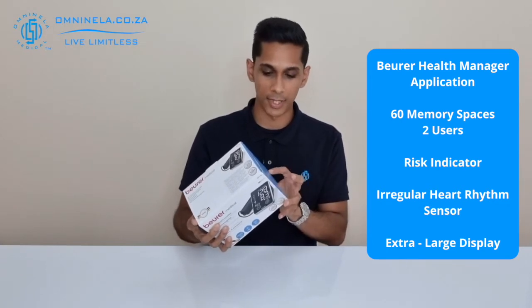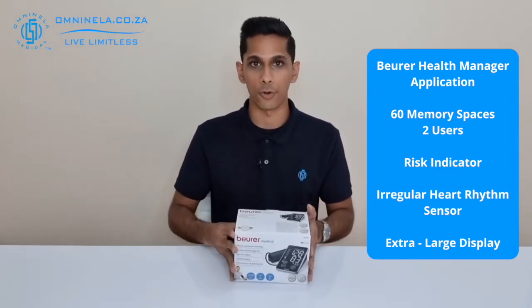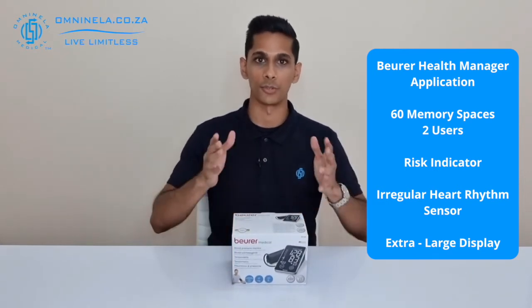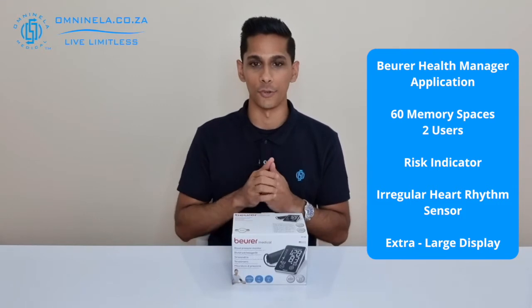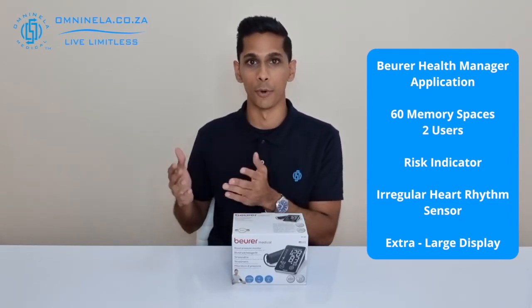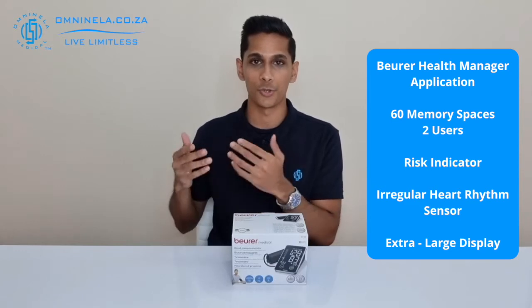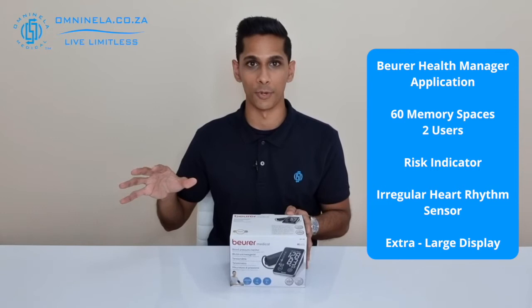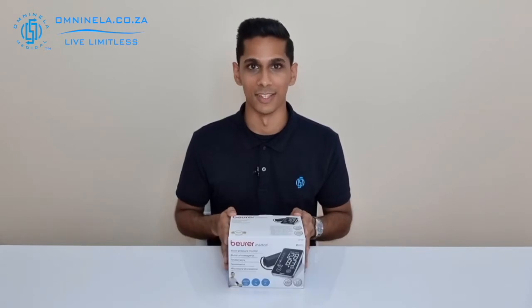This does come with four double-A batteries, which is the primary source of power, and also a USB cable so that you can connect this device to your computer and use the Beurer Health Manager app to download all of the readings onto your computer and send them to your doctor if need be. So let's open this up and have a quick look at what comes with the device.